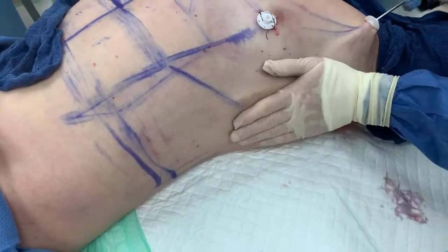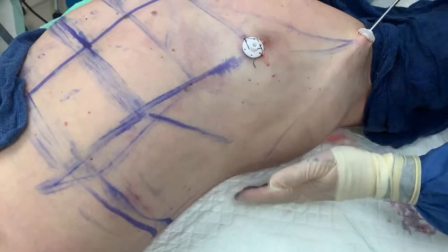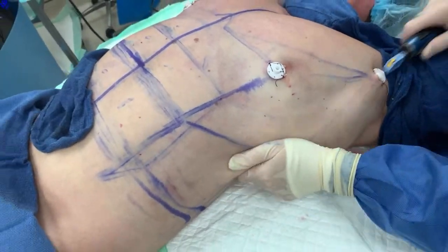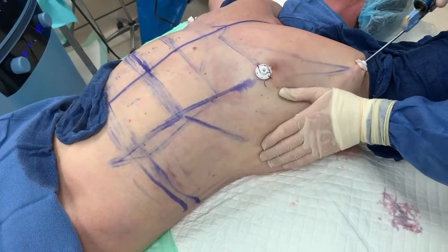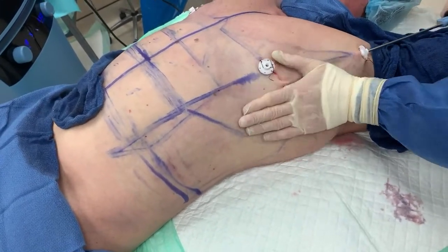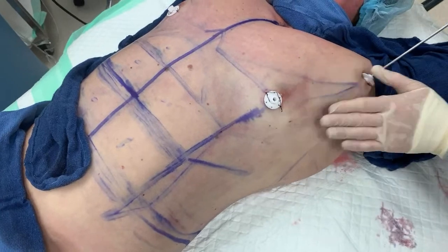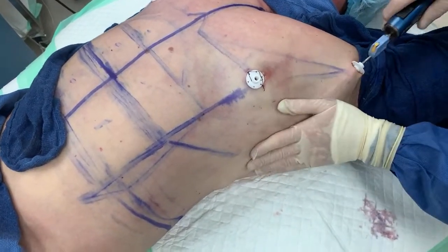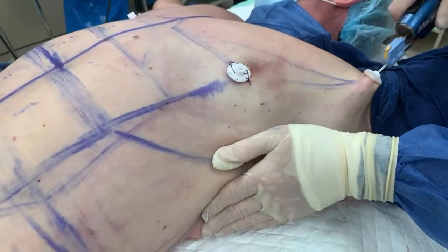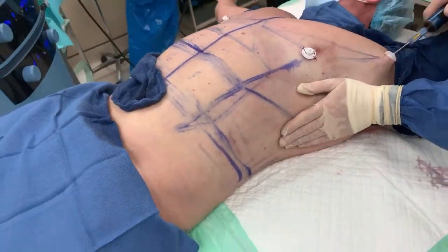Doctors who badmouth me — 'oh, he goes through the armpits, his nerves' — it's obviously ignorance. What's the recovery like on this type of surgery? This guy's in construction; he'll probably go back to work. He's going back tomorrow — but you're not lifting. I'm going to see him tomorrow; I see him at 24 and 48 hours. He's going to do some desk work. I'm doing the six-pack — I'm not really doing the flanks, he doesn't need it, but I'm giving him the six-pack: two, two, four, and six.